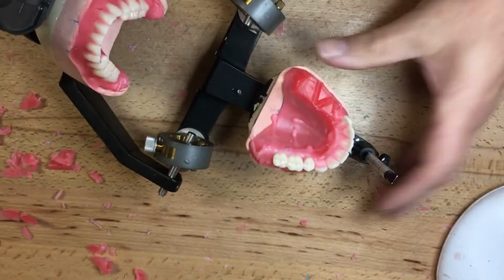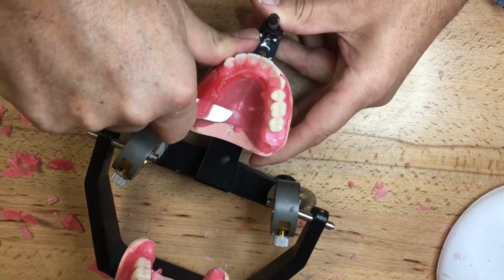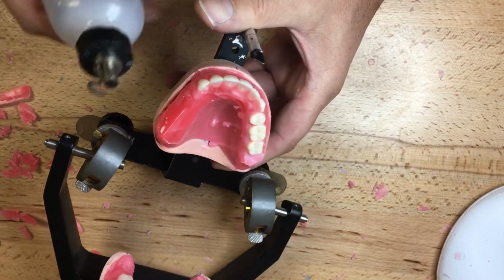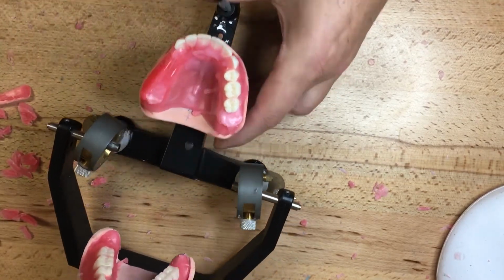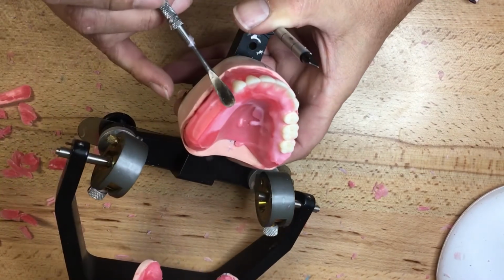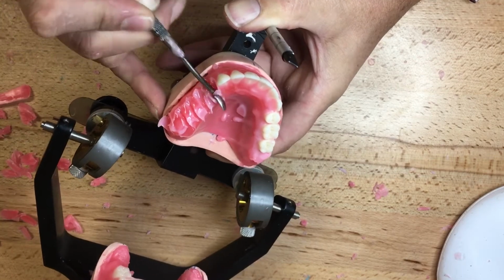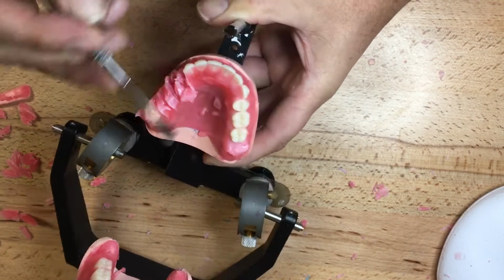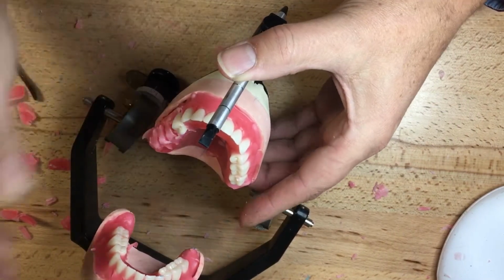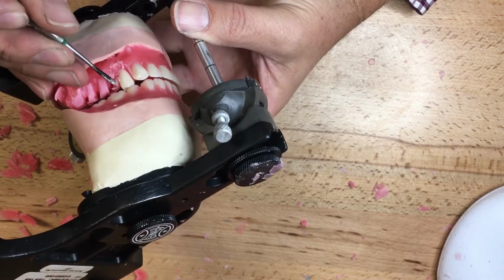So this side's done. I'll move over to the other side here. Reduce the wax to what I think I'm going to need to adhere the denture teeth in the wax. I'm going to heat up the wax. Now I'm anticipating this side to be similar to the other side. Should line up okay. I'll put in number 5. And it's a tooth-to-tooth relationship where number 5 falls into the distal fossa of the lower 5.